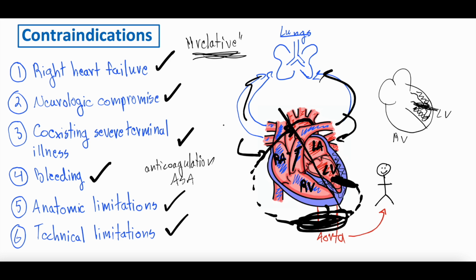All right. The only other thing about anatomy, now that I'm thinking about it, that I didn't say is remember the heart keeps beating. So not only are you getting flow from the LVAD, so the LVAD sucking blood out of the left ventricle, going through the pump into the aorta, shooting that blood into the aorta to go around the body, but the heart is still working. So even if your ejection fraction is only 15%, that means your heart is still able to squeeze 15% of its blood out of the left ventricle into the aorta. So patients get both their native ejection fraction as well as the LVAD flow to help perfuse the body, just if I didn't mention that above.